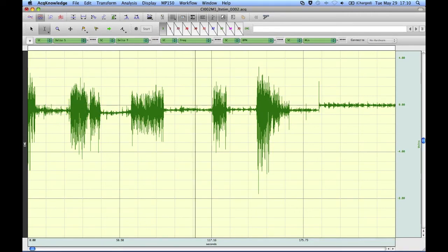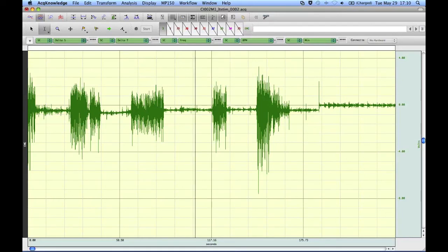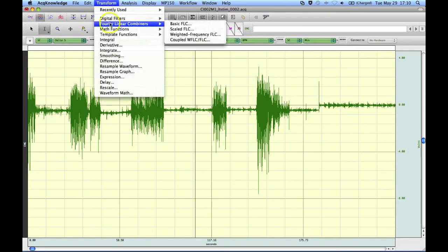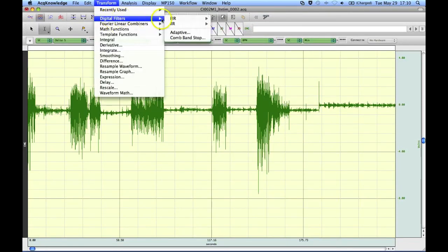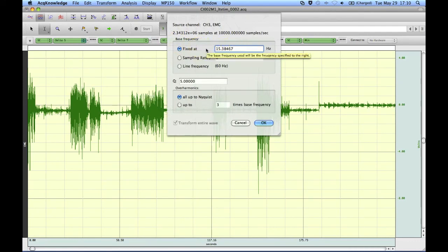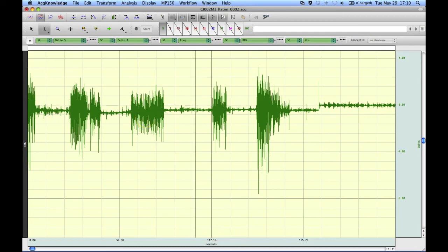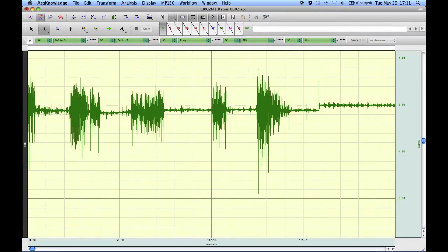So that gives you a quick demonstration of how to use the FFT, Fast Fourier Transformation, to identify the frequency components of the noise, and then use the comb band stop filter to take out that frequency component all the way through all the different harmonics. And then what you end up with is hopefully a nice clean EMG signal, or whatever signal it is you're looking for. Anyway, that concludes our demonstration of the FFT and comb band stop filter.